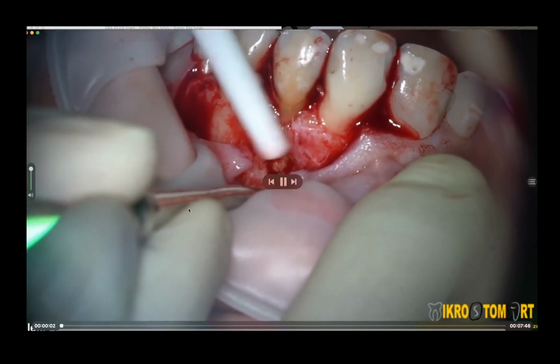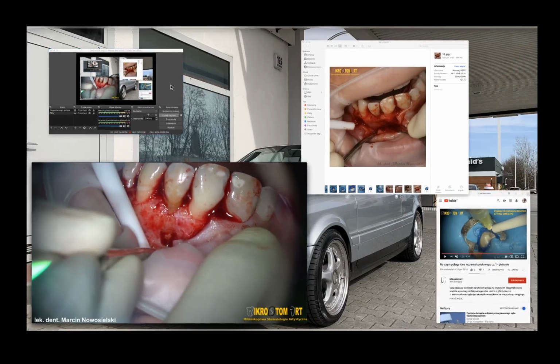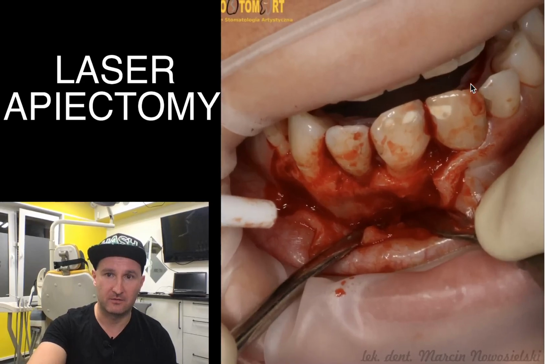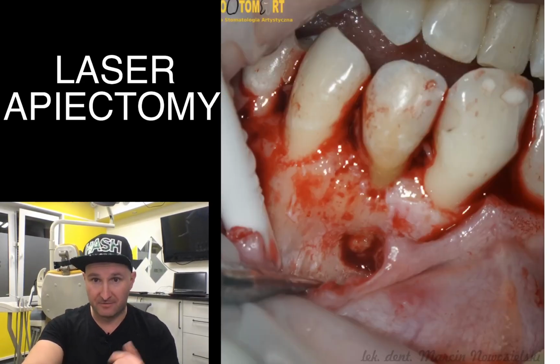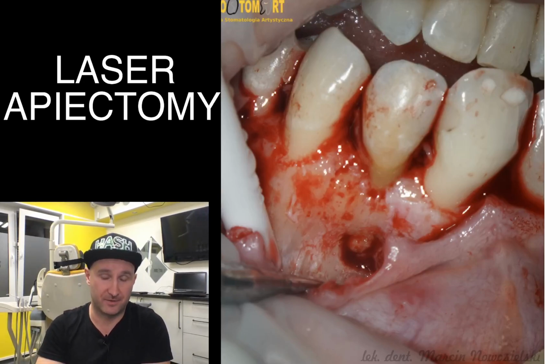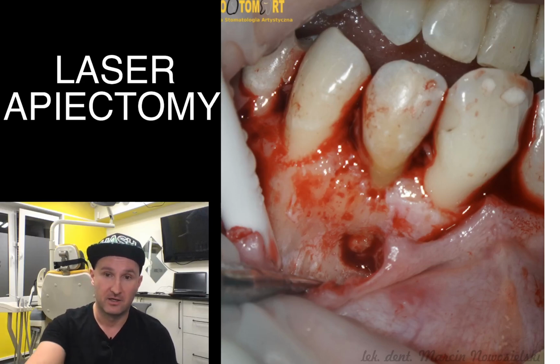The other thing that is very important in this case is that I can see the operating field very well during this process. In fact, my visibility is the best and much better compared to the traditional way. So it is also very important because I can proceed with my entire protocol much faster.